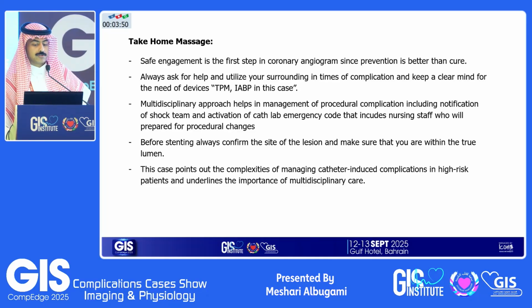A multidisciplinary approach helps in management of procedural complications, including notification of the shock team and activation of a cath lab emergency code that includes nursing staff who will be prepared for procedural changes. Before stenting, always confirm that you are at the site of the lesion and make sure that you are within the true lumen. This case points out the complexity of managing catheter-induced complications in a high-risk patient, and underlines the importance of multidisciplinary care.